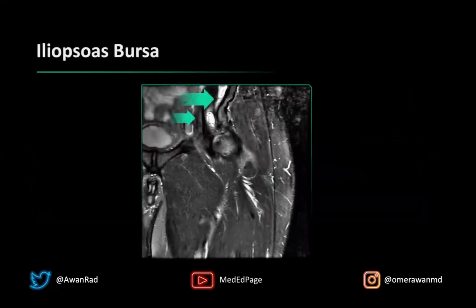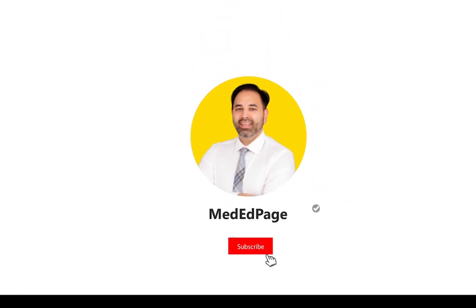To end, here is a coronal image of the hip showing another example of the iliopsoas bursa. You can see the iliac bone, the femoral head articulating with the acetabulum, and deep to the iliopsoas/iliacus muscle there is fluid tracking deep to the iliopsoas tendon, which eventually inserts along the lesser trochanter. This fluid deep to the iliopsoas is the iliopsoas bursa. Thank you for your attention — hope that was helpful. Tune in next week for another high-yield MSK unknown case.